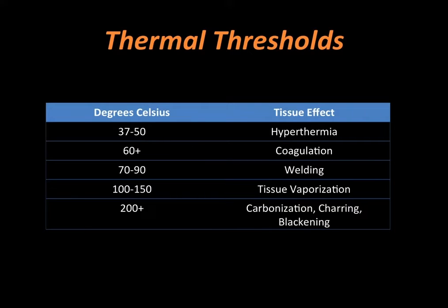We'll get blood coagulation early on in the process, which is a good thing. So when we're using our dental diode laser, we don't see a lot of excessive bleeding as we would with a scalpel. To coagulate, you can power the laser down and you don't need to risk unintentional cutting if you're only trying to coagulate something. You can always see where you're overheating the area and you'll get charring of the tissue.